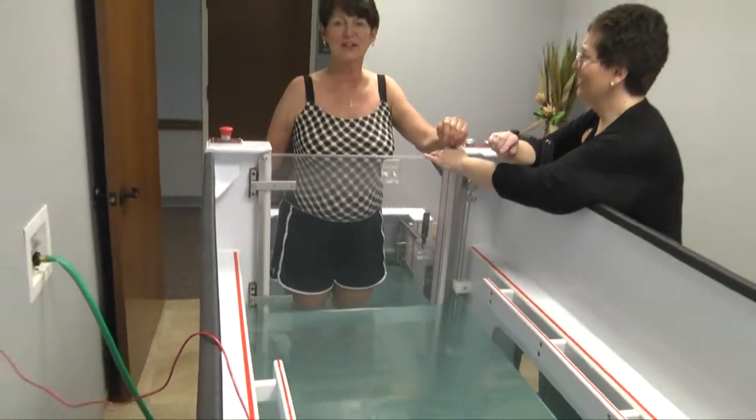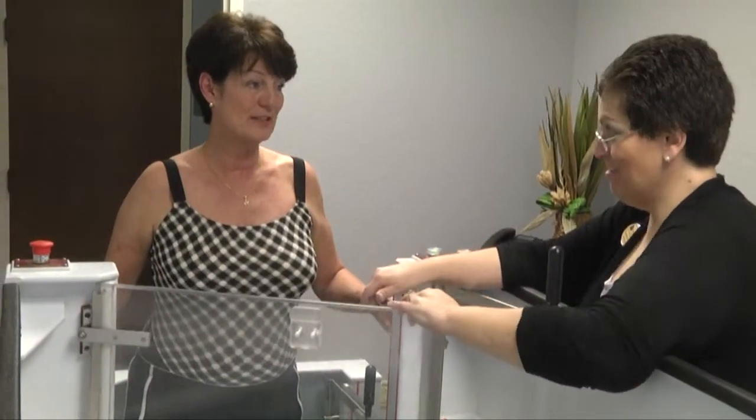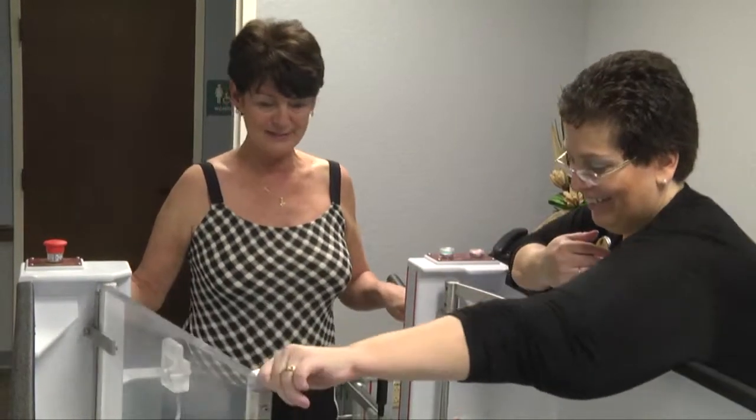Once the water is even in the foyer, then you can actually open the main door, allow the patient into the tank, close the main door behind the patient, and secure it.